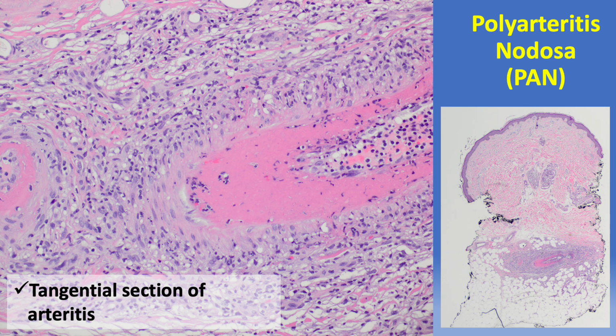With vasculitis affecting larger vessels, such as the medium vessel vasculitis in PAN, the distinction between artery and muscular walled vein can become more diagnostically critical. And some textbooks will tell you that arteries are more round and veins tend to be oval. But as I just showed you, that's not always true because it assumes an ideal cross-section, which we basically can never assume.